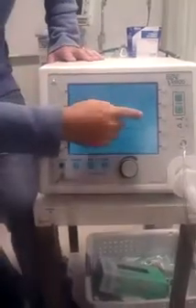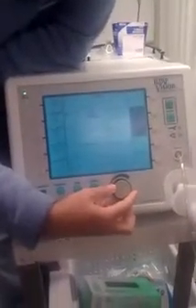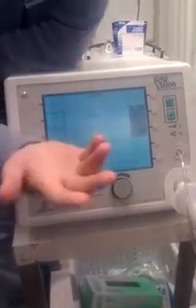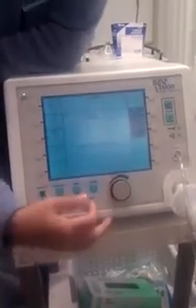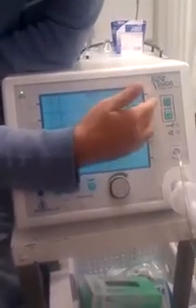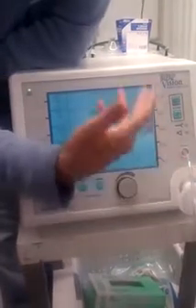Now this being here, the inspiratory time. If you take a look here, look what happens when you increase the inspiratory rise time. You're getting that breath in at a quicker time or a slower time, whichever one you want. I prefer 0.4. I give more inspiratory time. If you decrease the inspiratory time, you increase the expiratory time on the pressure when it goes in. Watch him. Ready? This is 0.4.